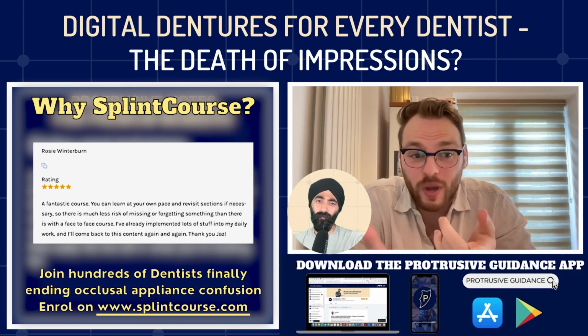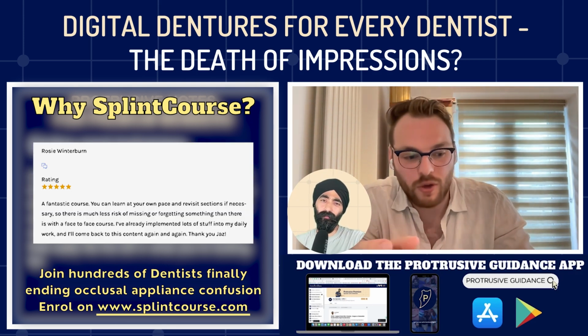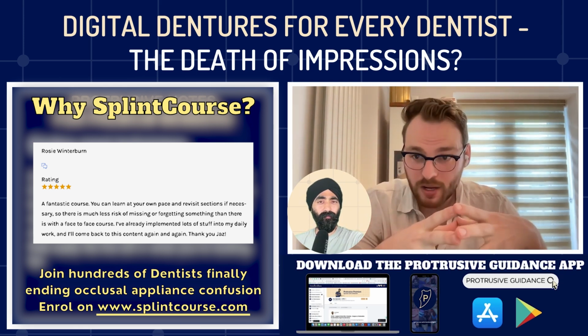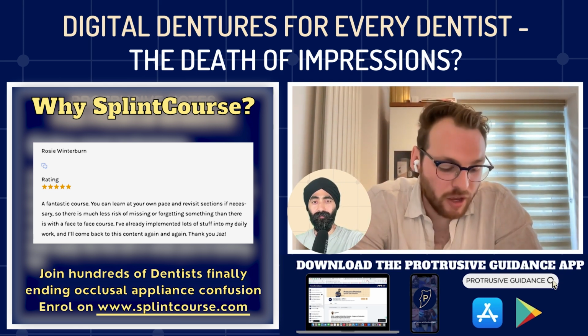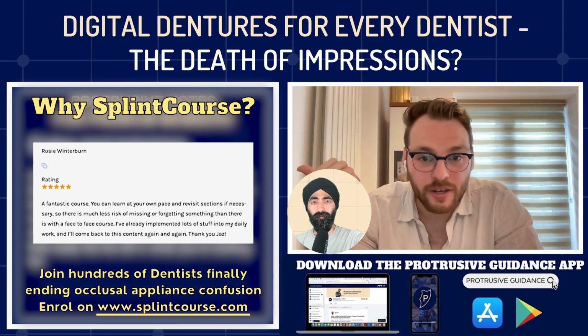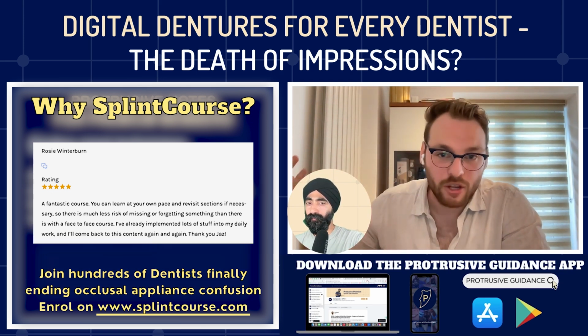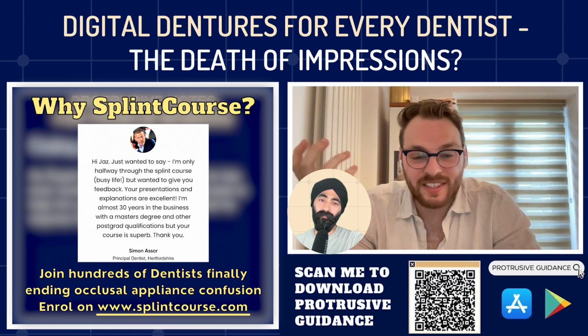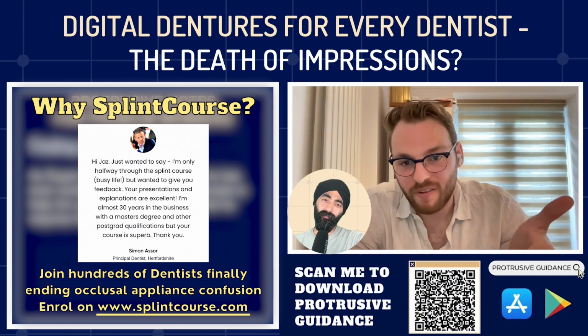And this is where the digital gets really cool. We did a case where I did all my stuff in Reading, and actually it was a case with Ivoclar, and we sent it to a guy in Canada who's like the best guy in the world, a guy called Eric Kukuka. Sent it over to Canada. He designed it. He sent it back to Ivoclar to mill it, and then I fitted it.